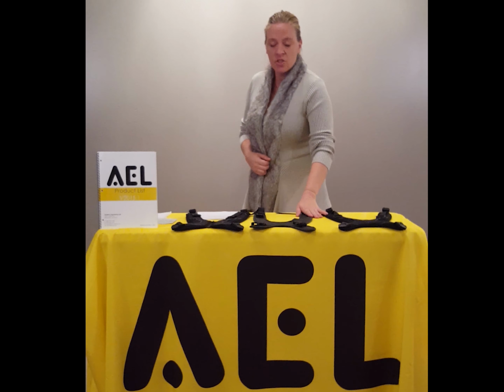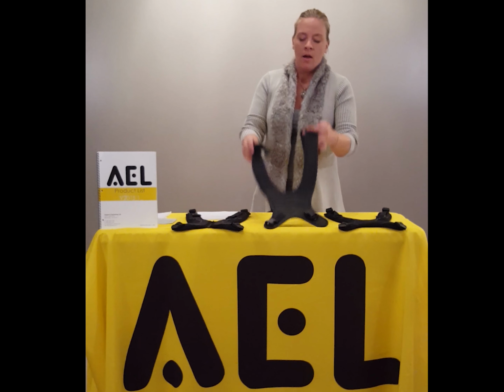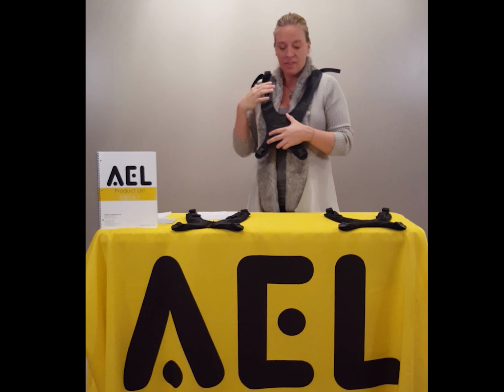Moving on to the non-stretch option. In a situation where a non-stretch option is preferred, you may have a client who needs a more rigid, solid, stable, less forgiving anterior support.